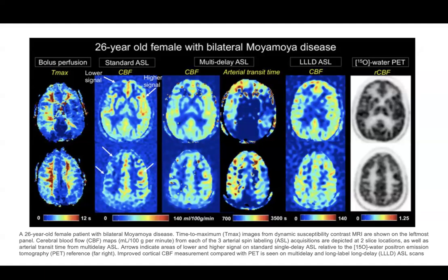What we are doing is that if we don't have a single delay, in Moyamoya disease we are using multiple delays, at multiple time points, and seeing how progressively these areas are filled. That gives an idea about which area has steal and which is the most acutely hypoperfused, vulnerable area which can be reperfused first. But that is not equivalent to collateral channels.